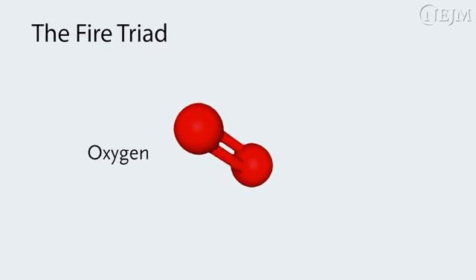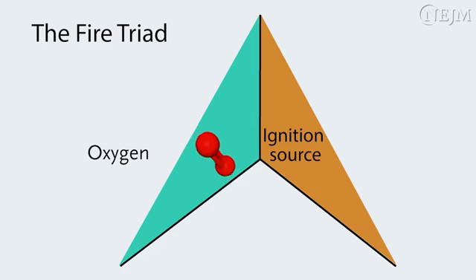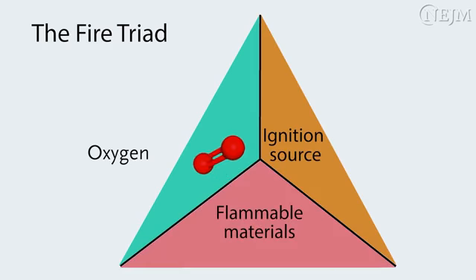Oxygen supports and accelerates combustion and causes materials to ignite and burn more rapidly. To minimize the risk of fire during the administration of supplemental oxygen, it is important to avoid contact with sources of ignition and flammable materials.